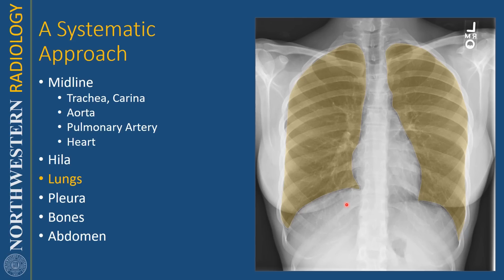Once I've evaluated one lung, I zoom out and look at both lungs to look for symmetry — making sure they're the same density, the same size generally (usually the left is a little bit smaller because of the heart orientation), and that the vessel arborization is about the same.